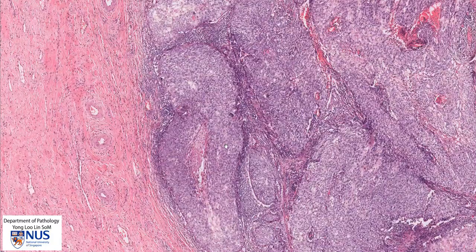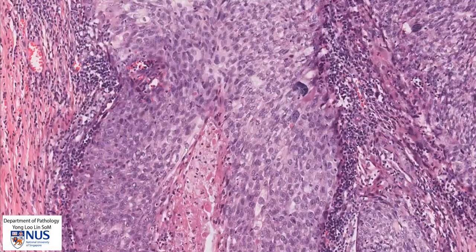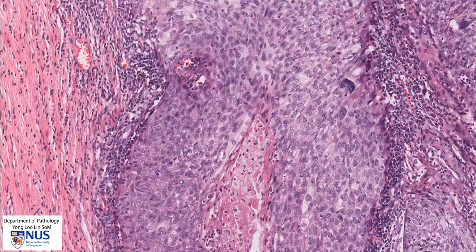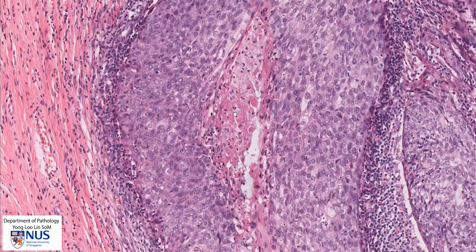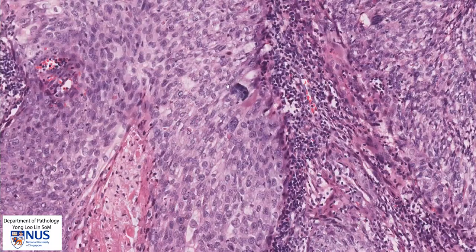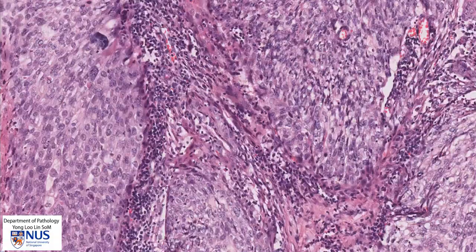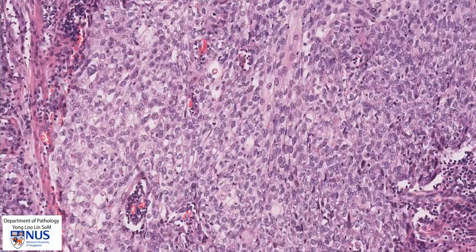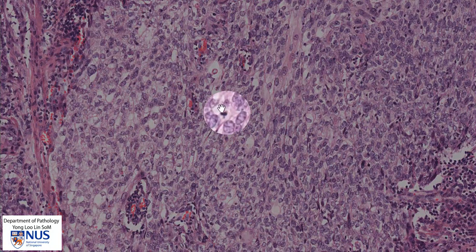We can also see that right next to these invasive islands of tumor, there is a lot of inflammation — a lot of lymphocytes coming in around the tumor. Here are some areas of necrosis, and we can see individual cell apoptosis. There is some keratinization of individual cells with very orange cytoplasm, and a very large pleomorphic cell here. We can also see some mitotic figures among the malignant cells.